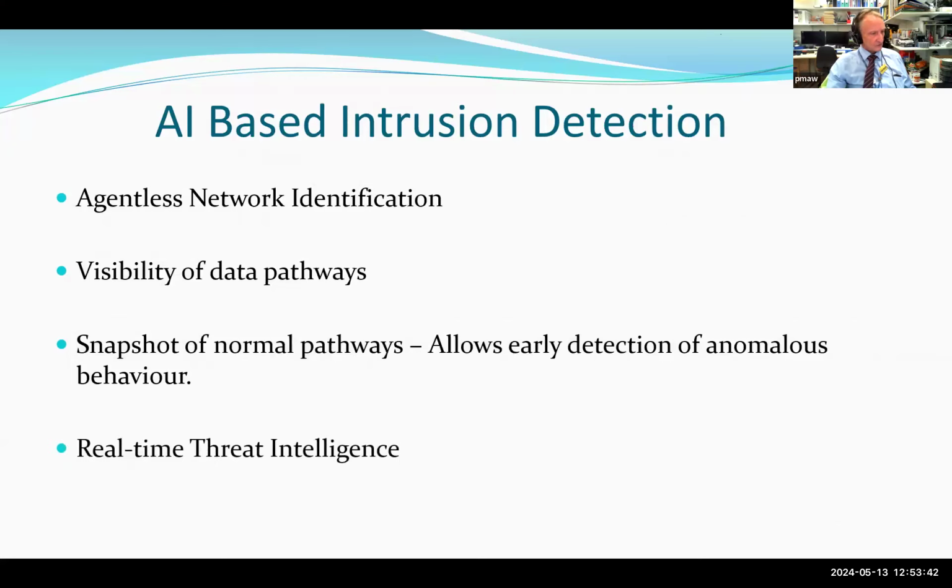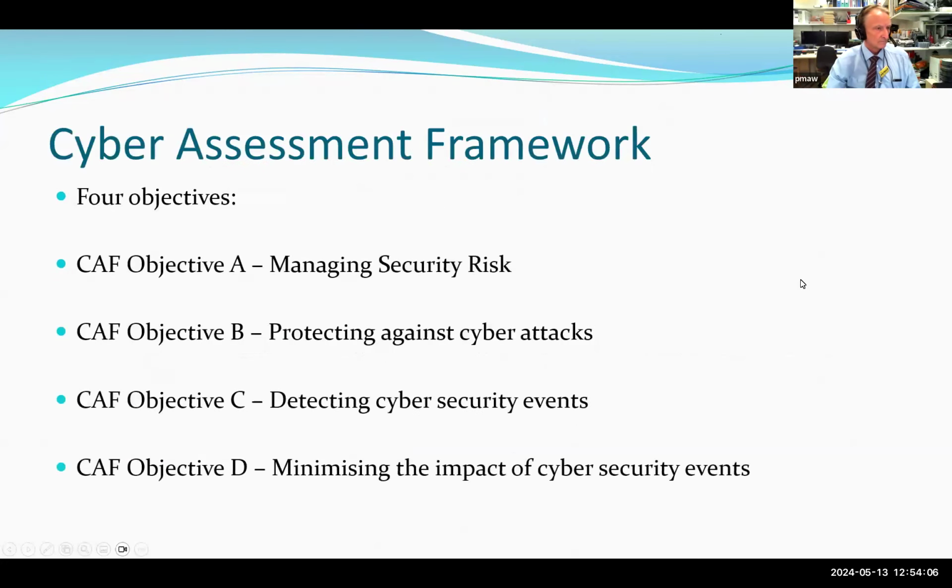And then they give you real-time threat intelligence. They're linking into all the sources of threat intelligence for medical devices, and they will identify which particular devices on your network are potentially the subject of compromises. So it gives you an indication as to where to concentrate your effort. Right, so that was the intrusion detection system.